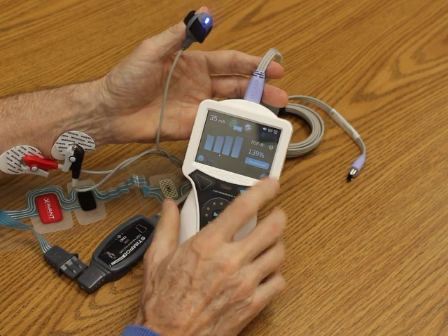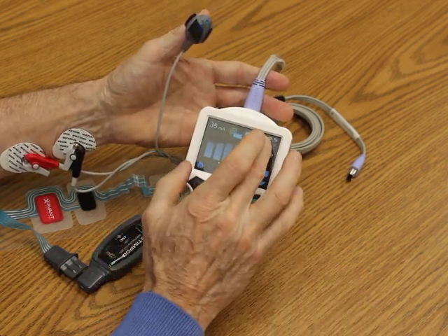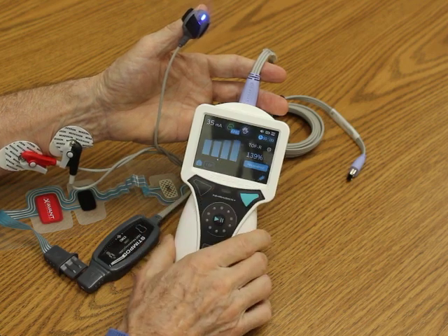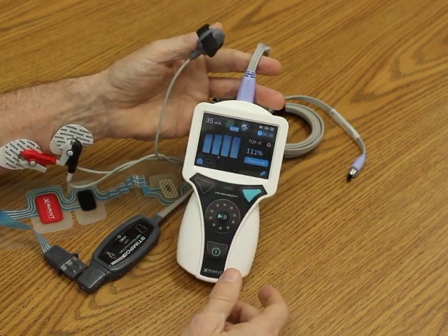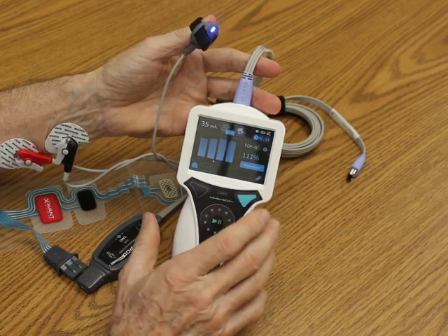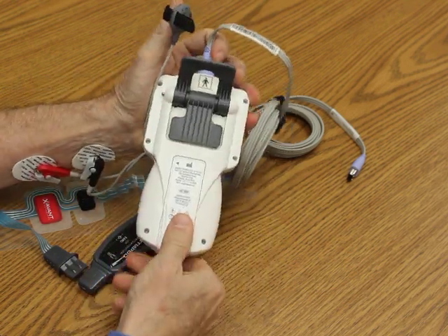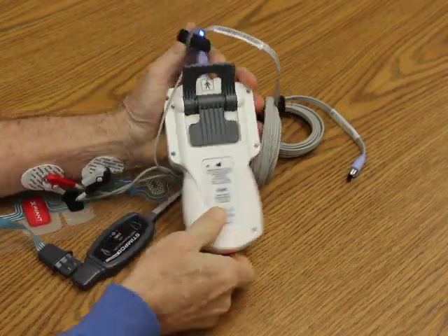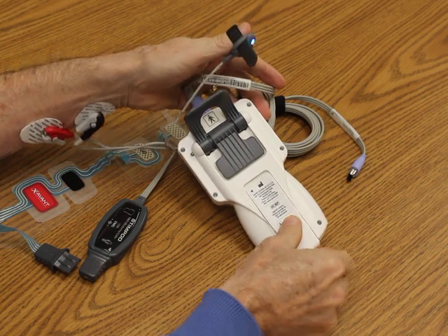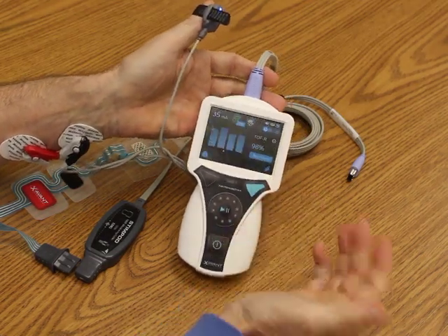Once again I can use the drug key. The green dot means I'm recording — and that's how easy it is to use. I can hit the timer again, turn the timer on, go to every 30 seconds, and confirm. So now it's going to do a train of four every 30 seconds. To summarize: the Stimpod 450X Plus has a color touchscreen display, it's a larger display, and it uses a rechargeable battery rather than four AA batteries with a 40-hour battery life. There we're getting zapped — we're at 96% and recovered, so I don't have any paralytic on board.